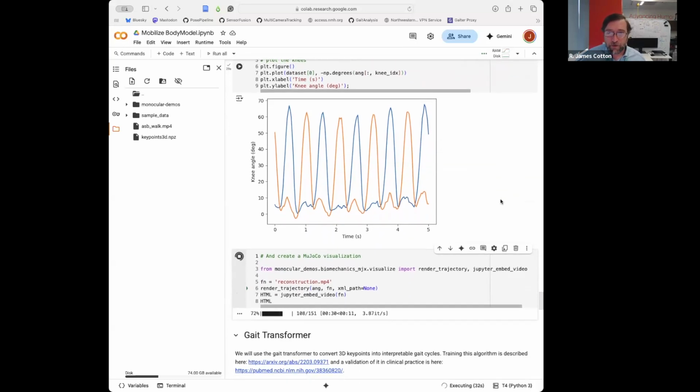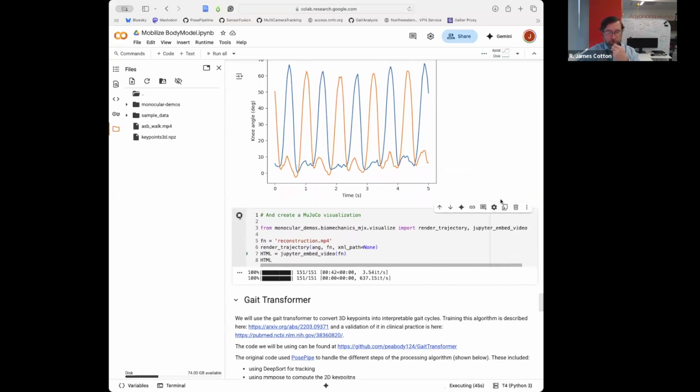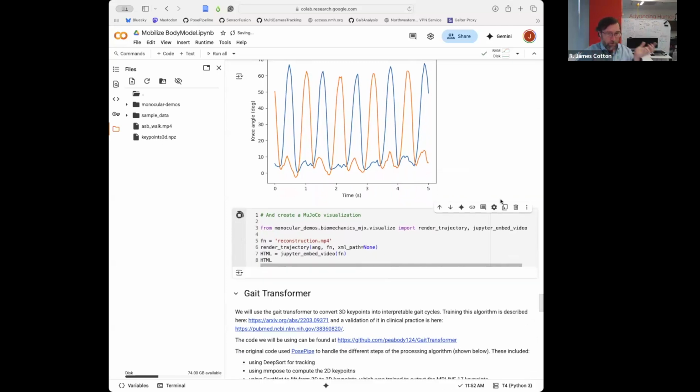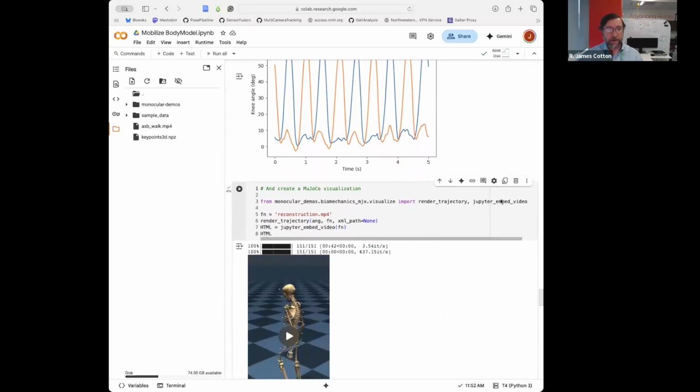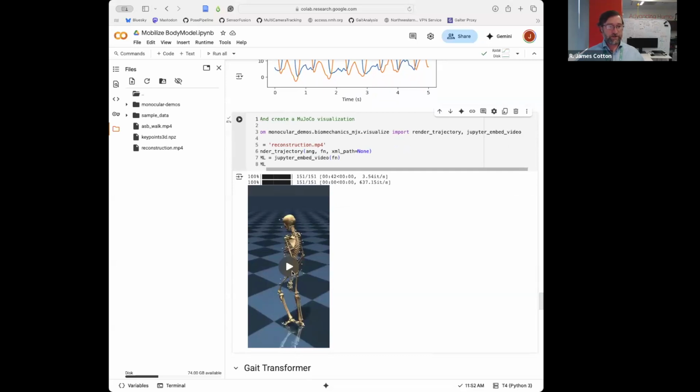Okay, and then can this work in future in sports movement analysis? Yeah, we've done this. My personal research area is not sports medicine, but we are using this in multiple sports projects, including with our multi-camera system and our single camera system. And again, this is where making this measurement accessible opens up a lot of questions.